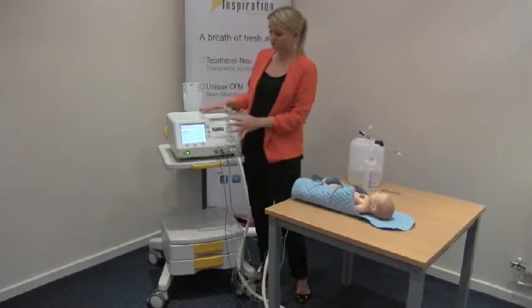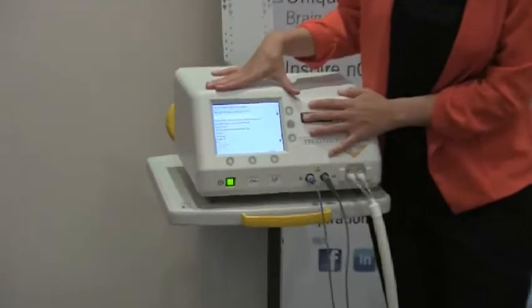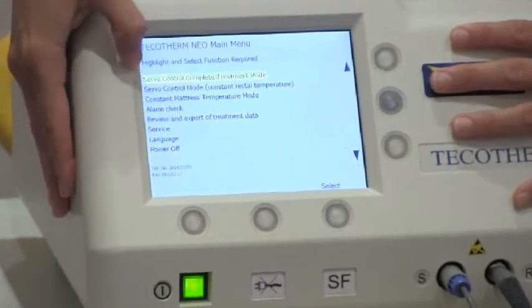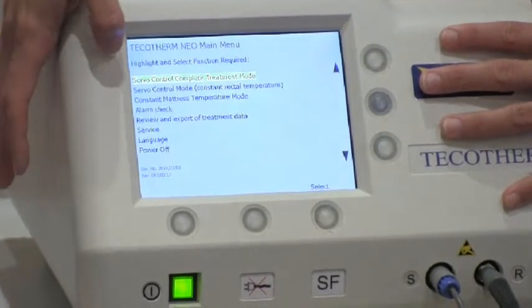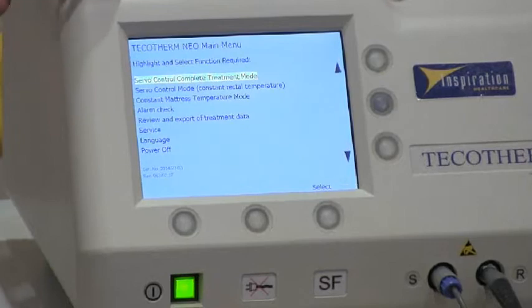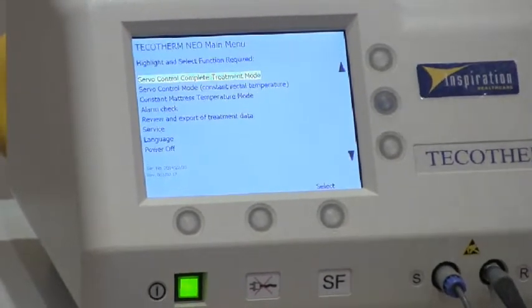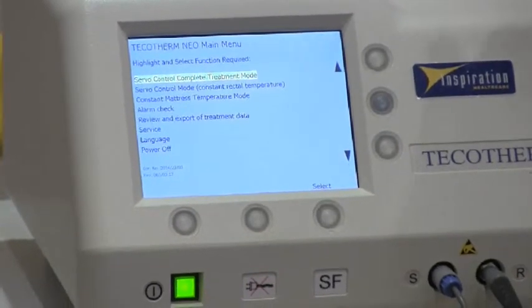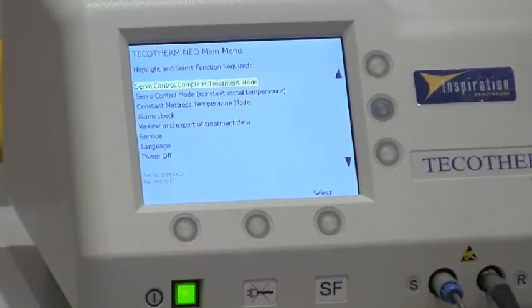Now we need to go to our on-screen operation. Our main menu is showing, and you can choose one of three modes. The simplest mode to use is the Servo Control Complete Treatment mode. This will allow you to cool the baby down to target temperature as quickly as possible, maintain that temperature for your desired time — typically 72 hours — and it will automatically re-warm the baby to normal temperature after treatment.